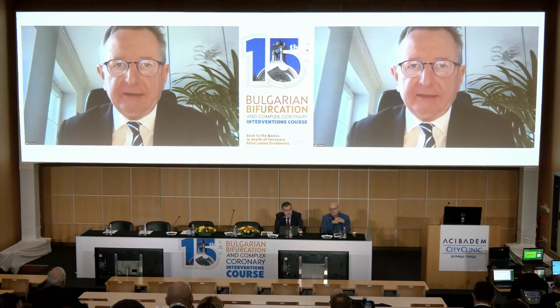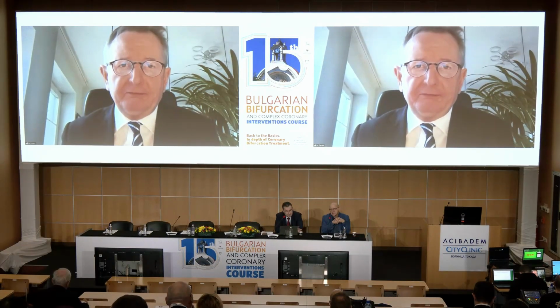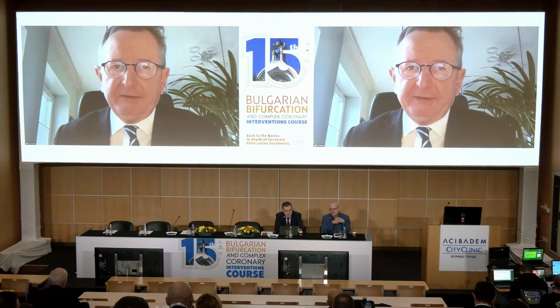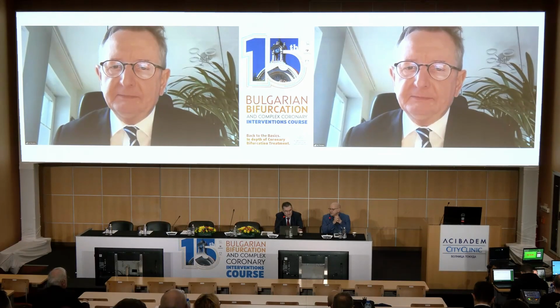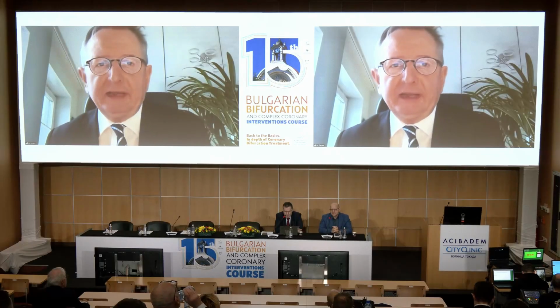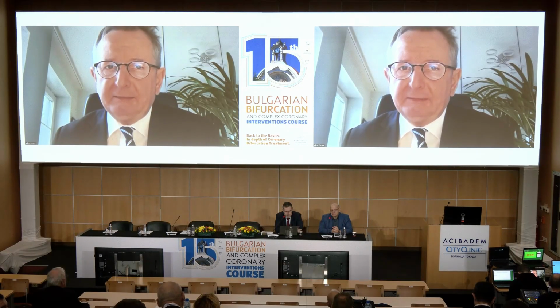We have much less situations where you feel okay just going forward and then you have burr entrapment. So this is much less since I started working this way, to prevent burr entrapment. And there are also issues with temperature, which is important, I mean, injury of the tissue. We do maybe 5 seconds per run now, not like many years back, 15, 20 seconds.